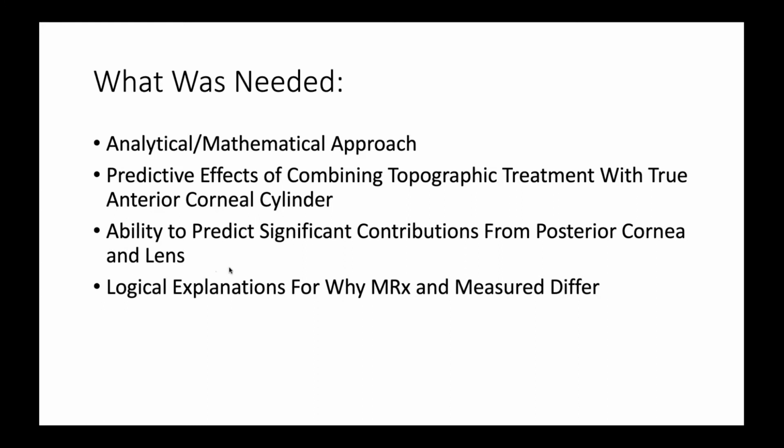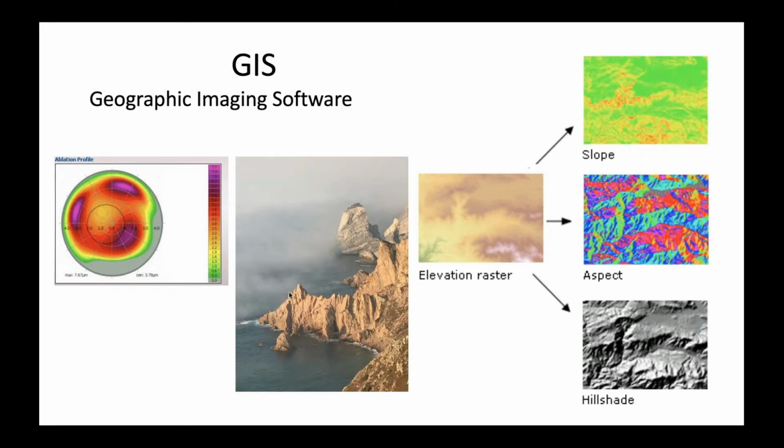And then finally, before I was going to put down a Contoura treatment on a patient's eye, I wanted a logical explanation for why the manifest and the measured differ. So this is what I set out to do.